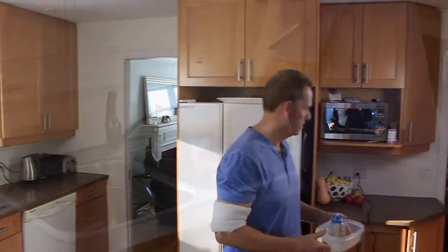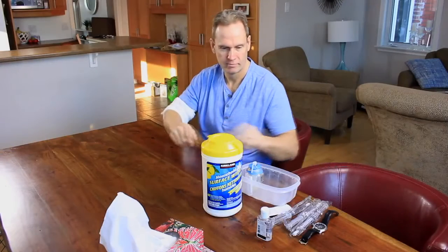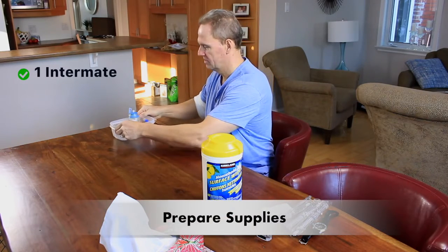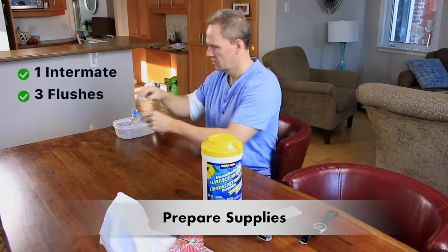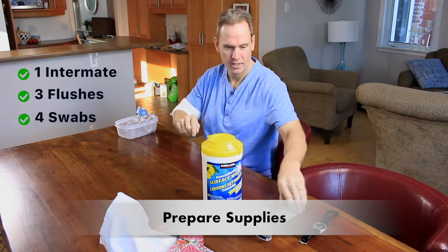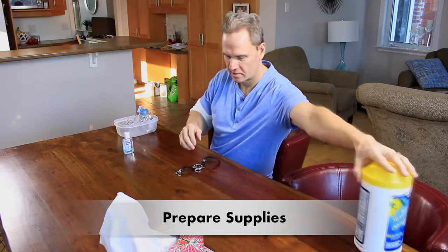You need to, of course, wash your hands as we described earlier so that there's no dirt on your hands. You need to get your supplies ready. So you need your Intermate pump. This medicine bottle is now warmed to room temperature. You need 3 flushes of salty water, and you need 4 alcohol swabs, or if your nurse told you to use chlorhexidine swabs, you can use those. If you have hand sanitizer, have it ready. It's handy to have a watch to time things.